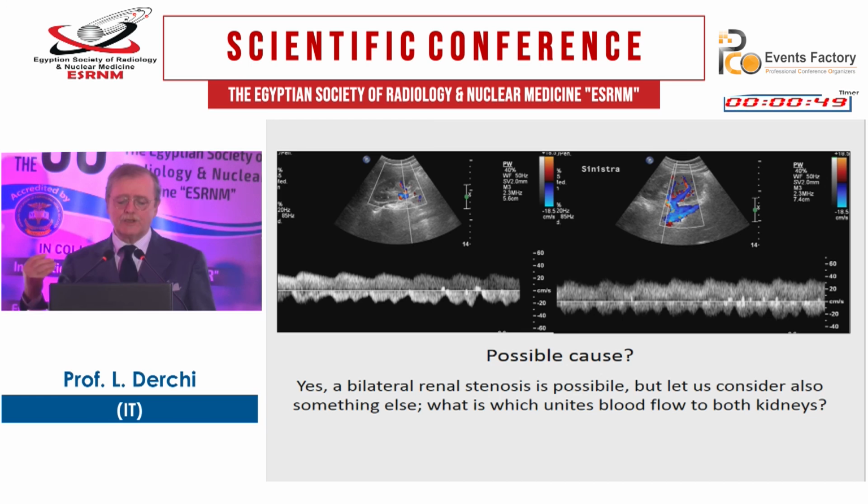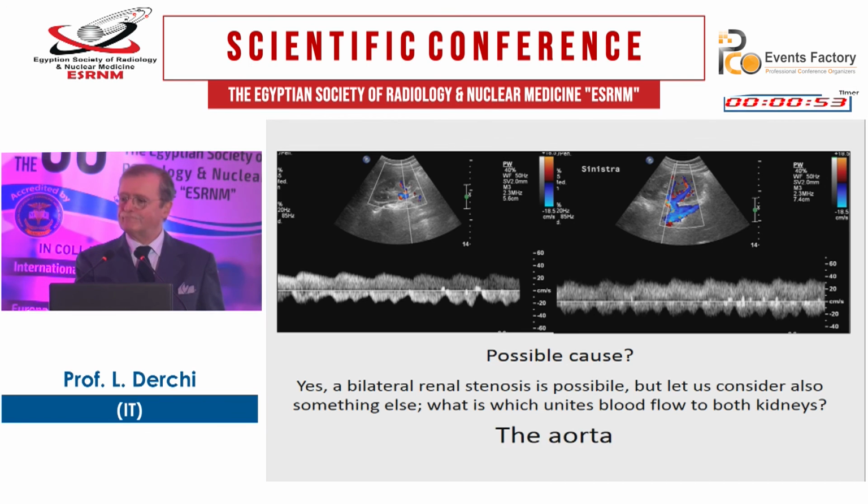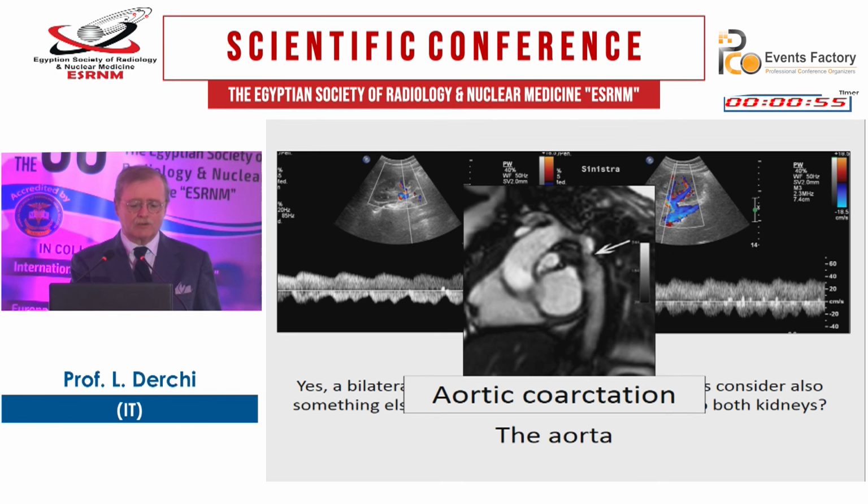What is it which unites blood flow in both kidneys? The aorta. As a matter of fact, she had an aortic coarctation.